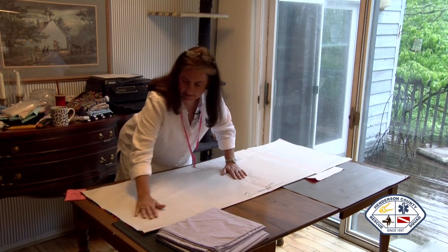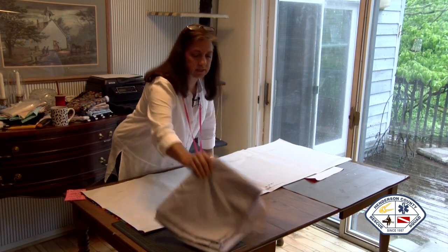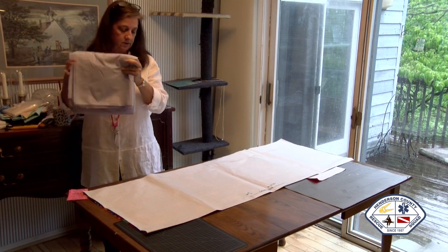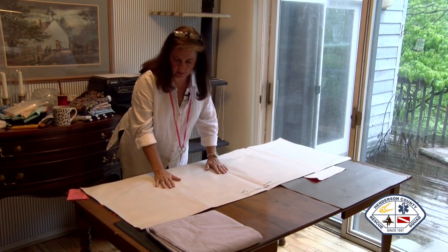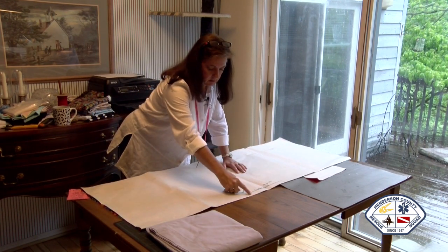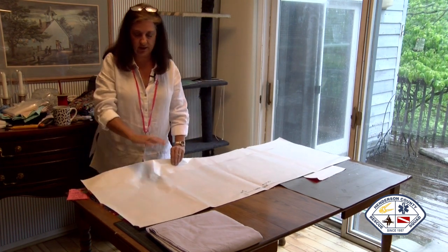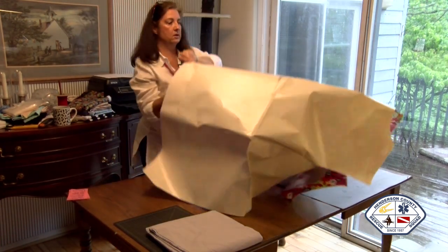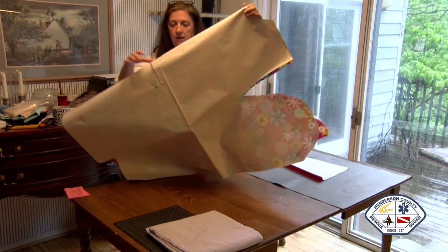So we need to cut our fabric, which has to be at least 44 inches wide and 57 inches long, or a sheet. A sheet is what I chose to use. I laid my sheet out and made it this long. On my paper, I've marked my center fold, 22 inches this way, 57 inches long. Once you've cut your paper, you take your pattern and fold it the other way, widthwise.